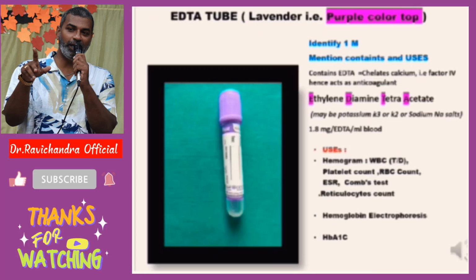EDTA tube, ethylenediaminetetraacetic acid tube. It is lavender topped or purple colored top. It contains EDTA, which will chelate the calcium and helps in anticoagulation. It is used in hemograms, platelet counts, and reticulocyte counts, and even in hemoglobin electrophoresis and HbA1c determination.